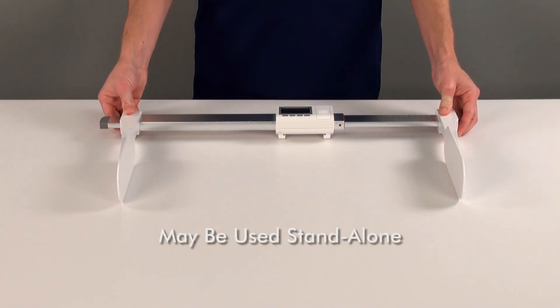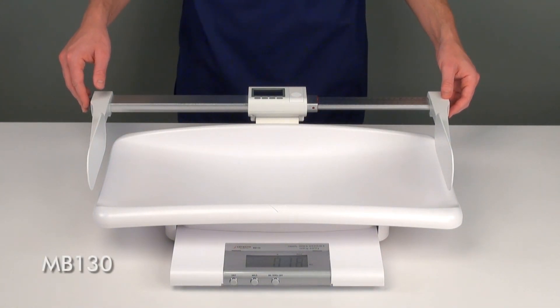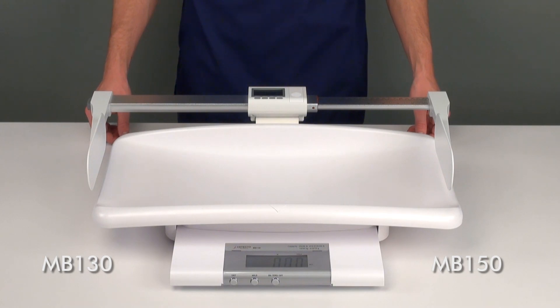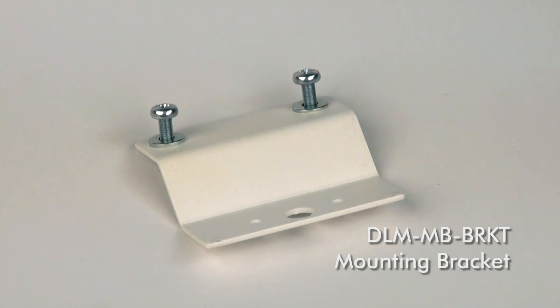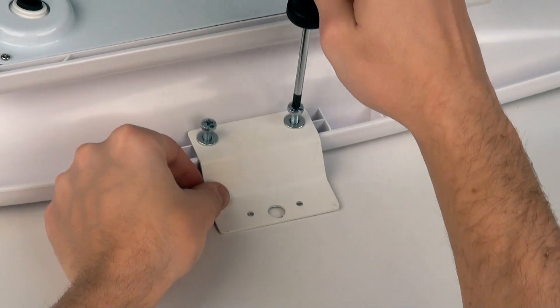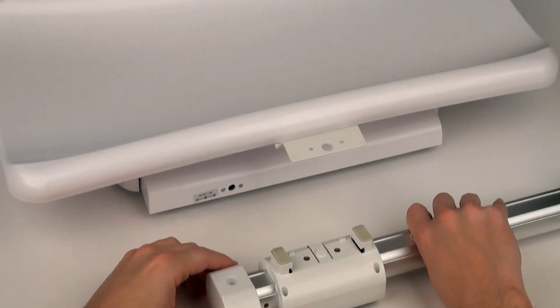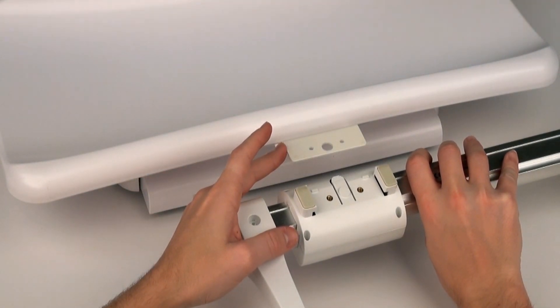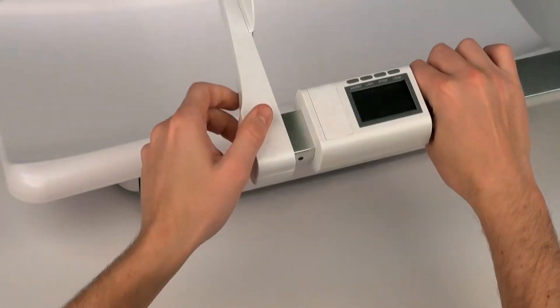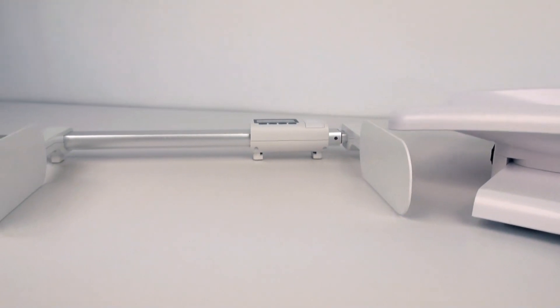This infant stadiometer may be used stand-alone on an exam table or attached to a Detecto model MB-130 or MB-150 digital infant scale with the inclusion of the optional model DLM-MB-BRKT mounting bracket, delivering height and weight measurements instantly. The mounting bracket is secured to the infant scale by two bolts inserted into the underside of the weighing tray. It is then attached to the back side of the LCD display of the DLM stadiometer via a locking release switch, which may be detached by simply pressing the release switch, allowing for independent use of the stadiometer when necessary.